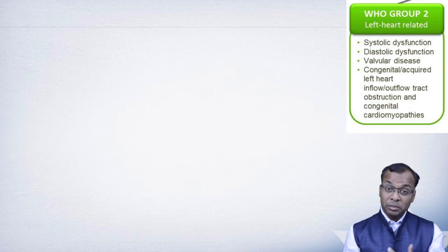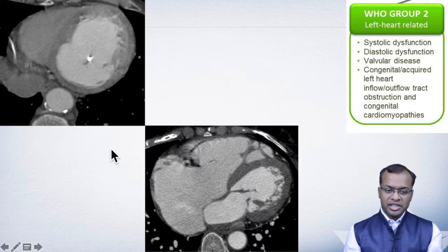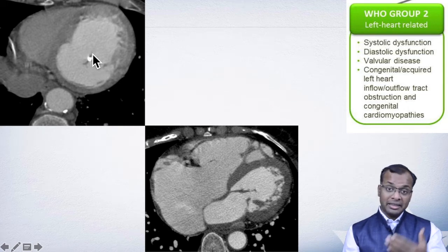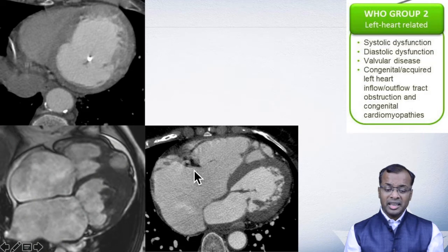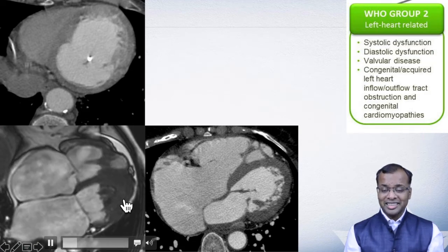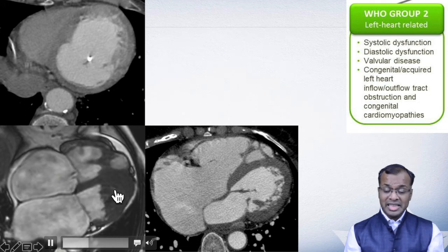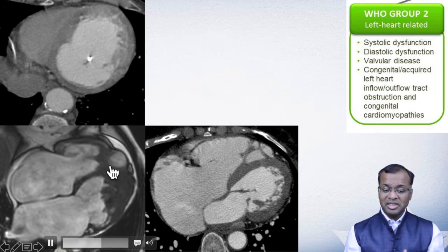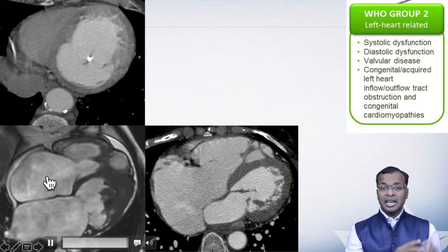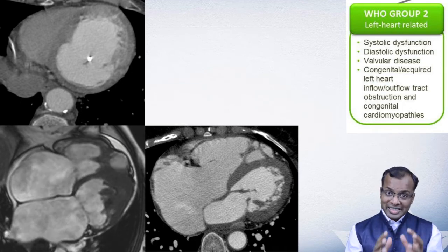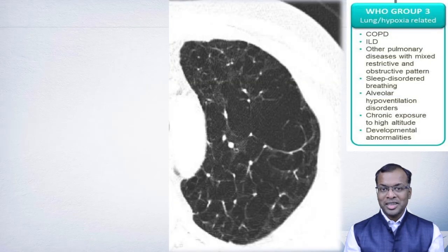Group 2 causes of PH primarily involve left heart pathology. LV dysfunction with mitral valve disease can cause pulmonary hypertension and CT can demonstrate this. We can see a patient with mitral stenosis and restrictive physiology. Another case shows endomyocardial fibrosis with both LV and RV involvement and dilated LA and RA, which accounts for pulmonary hypertension. CT is again very useful to show us what is happening.